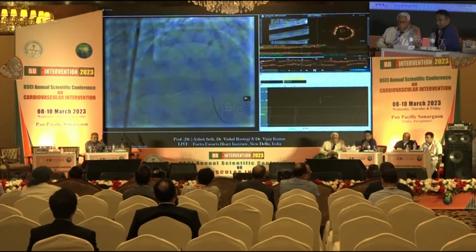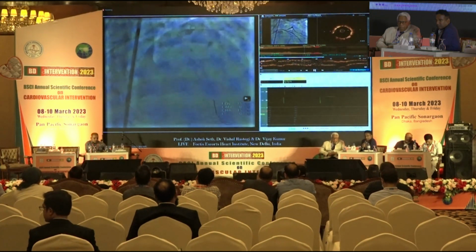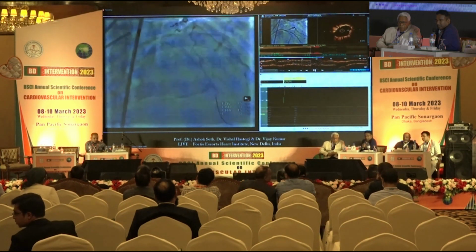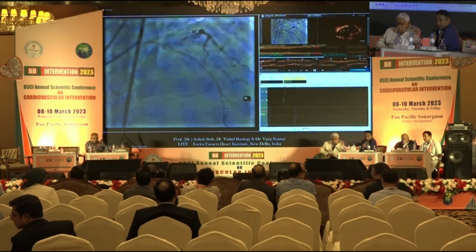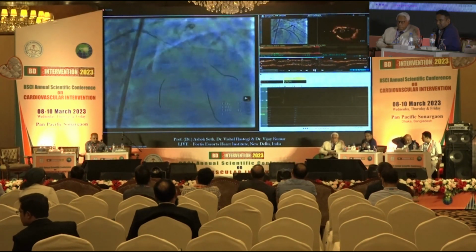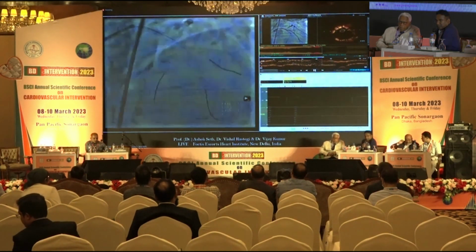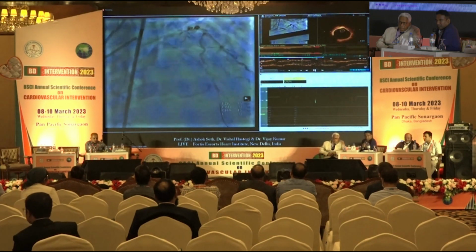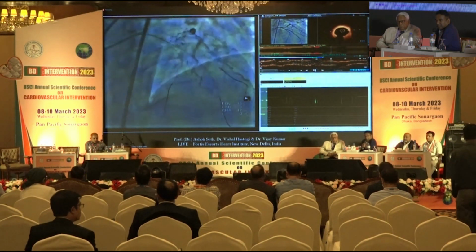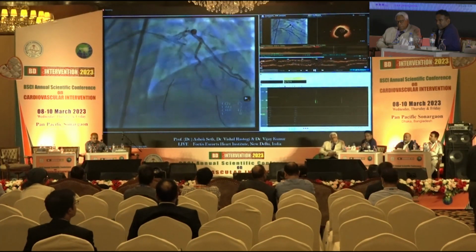We then lost the septal, as you can see. That caused him to be really ischemic and very uncomfortable with a lot of chest pain. So our next thing was to recross into that septal and get it back flowing. Once we recrossed into the septal and got it flowing, then we wanted to finish the job on the LAD diagonal D2 bifurcation.